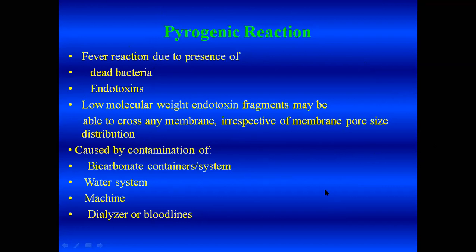There are some DNA fragments and low molecular weight endotoxin fragments which can cross any membrane, whether it's a dialysis membrane or an RO membrane. And unfortunately, the LAL test for endotoxin does not detect these. You would need to do a cytokine release assay to find out.